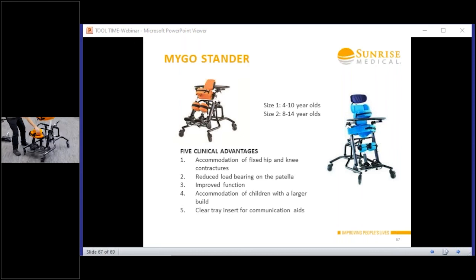So I'll show it from the front now just so you can see one's totally high. Purely by spinning that round, you're then keeping that level. Just giving you the different ideas. Nothing's not possible. There's always a chance you can change it and try something different. So if you're 80% happy with their position, work out what you're not happy with, and then identify the turn knobs that you need. And Leckey's so great, it's so difficult to get wrong.